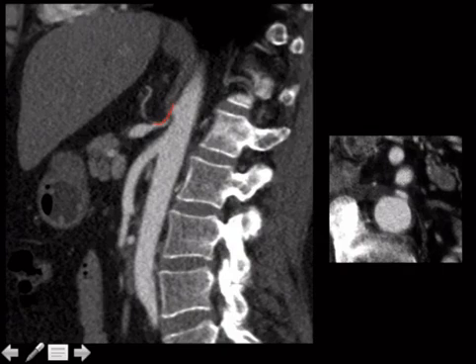That's how, if someone was going to show you this particular pathology, that's how they would show it on axial. It's much sneakier on axial. It would be way easier to tell what was going on on sagittal. In fact, it would almost be too easy, therefore it might be more likely to see it on axial.